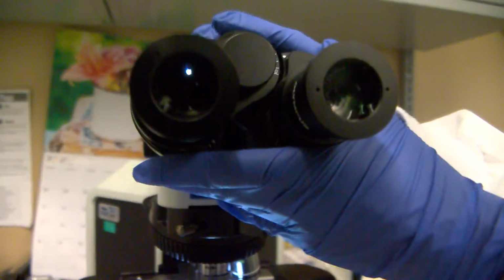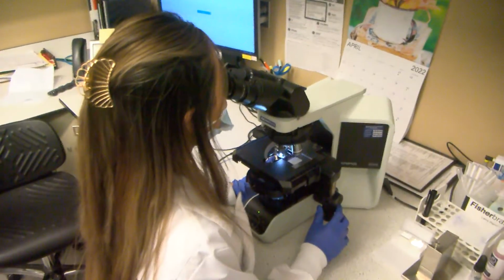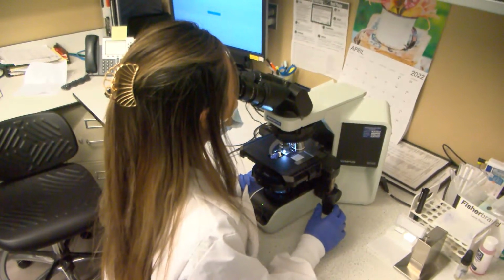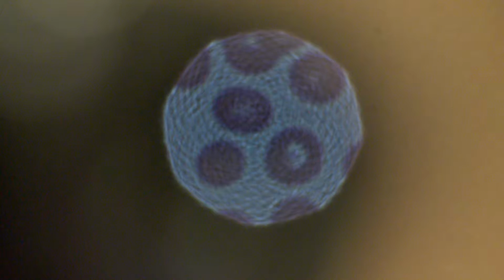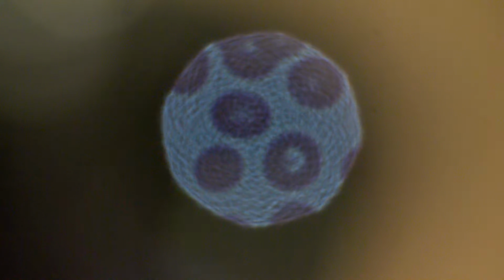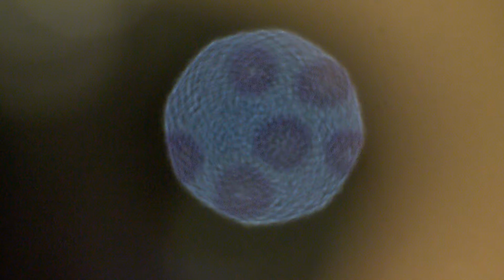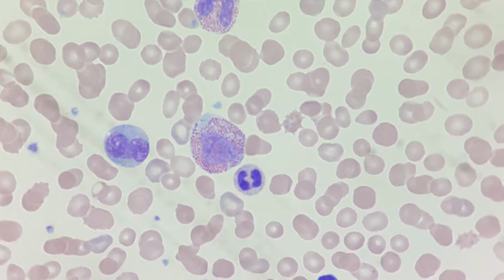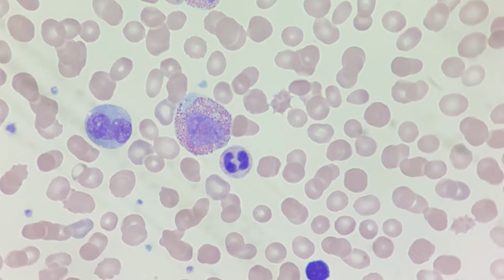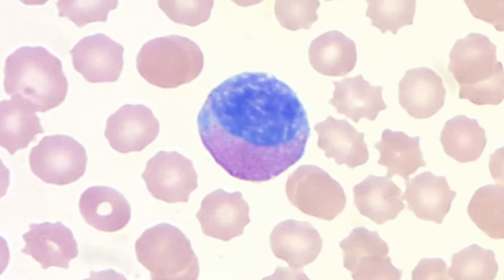This is how we can tell what kind of cells are circulating in your body, and this can help us diagnose things like leukemia, mononucleosis. If you have an infection, we might be able to see it in the blood. So right now you're looking at some red blood cells. We might be the first ones to see a cancer cell if somebody's in the earliest stages of leukemia. And we're all trained to detect abnormal white cells that might look like cancer.